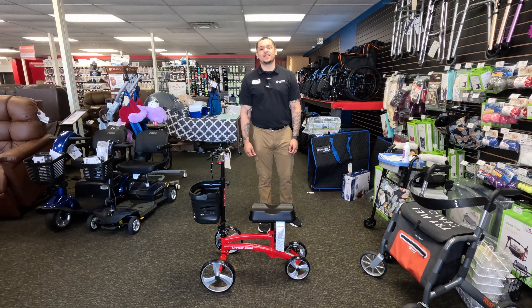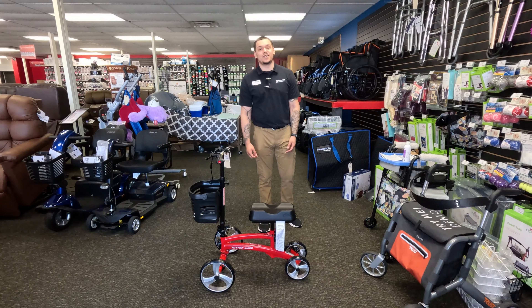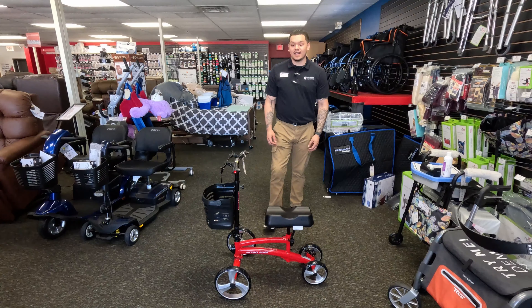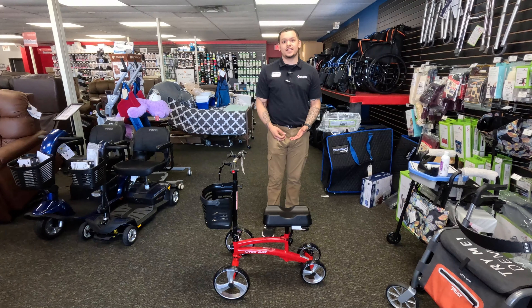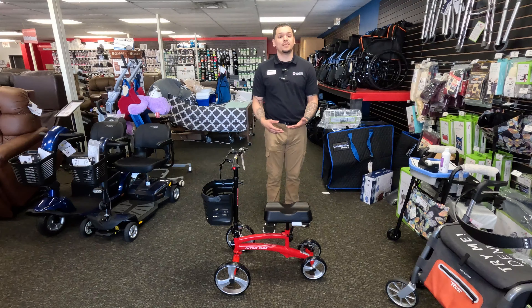Hello and welcome back to BHM University. My name is Marcus with Broadway Home Medical and today we're going to be talking about the DRIVE Nitro Glide Knee Walker. Now with the Glide, it does have a product weight of 23 pounds and a weight capacity of 350 pounds. It comes in this red and it also does come in a blue.